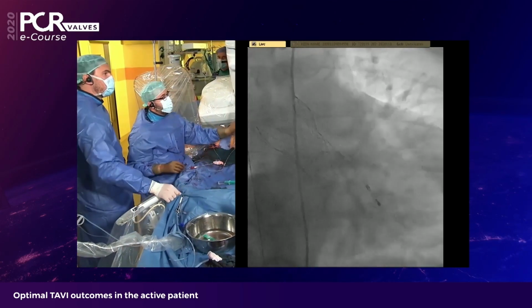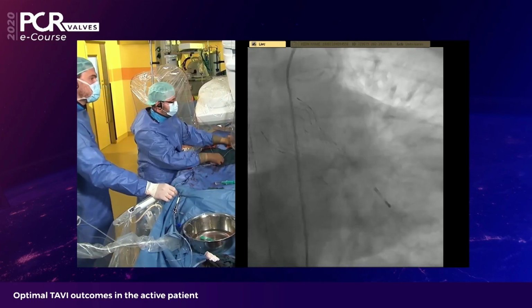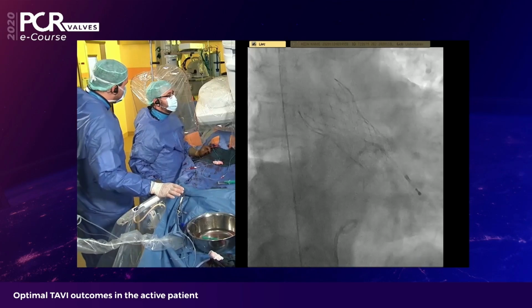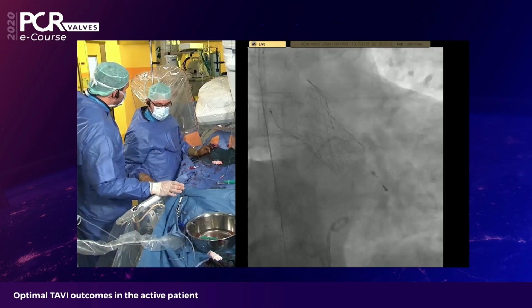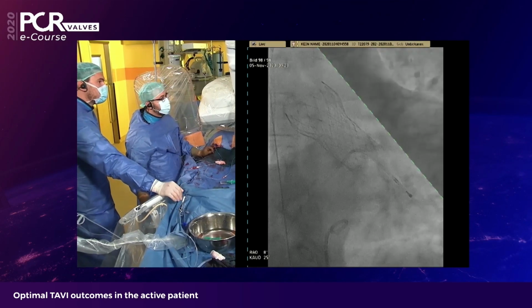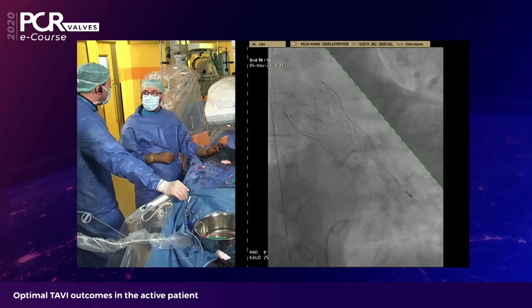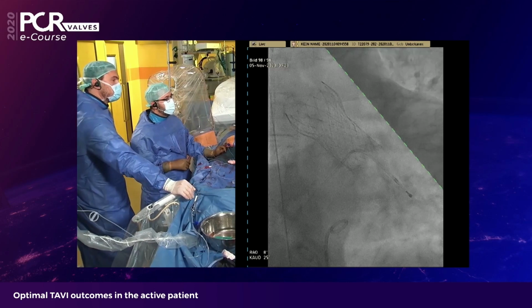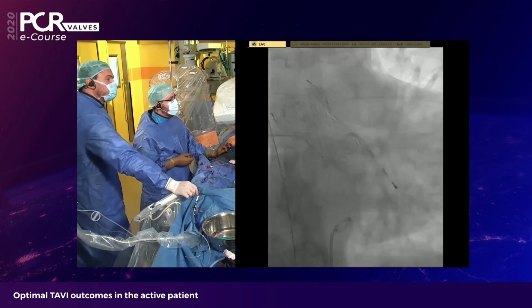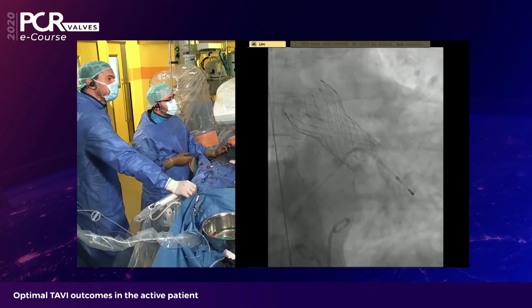Yeah. And another thing that always has to be mentioned is that the commissural alignment on the valve itself is on 26 millimeters. So that means you would cover in almost, or a lot of cases, the coronary access, and that's why alignment is really, really crucial in this patient. Exactly. I mean, it's double as high as the skirt. Exactly. Okay. So I'll do a picture here and I'll show you what I mean.